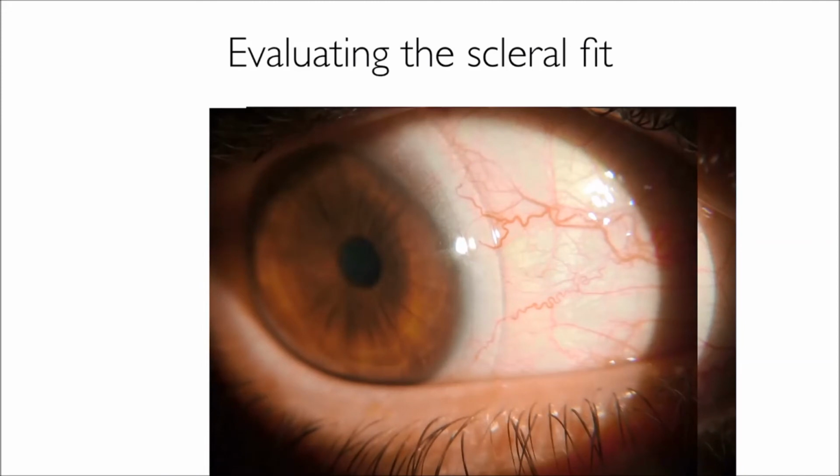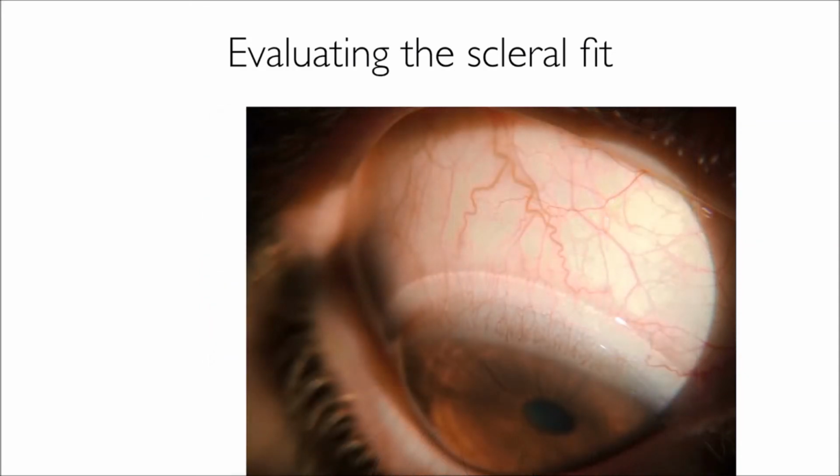They're not inflamed or engorged. It's pretty much normal conjunctiva. And as I look superiorly, I find the same thing. Now, one thing that you want to be aware of, when you have the patient look down, the lower lid can be pushing the lens against the eye and create what I call lid-induced blanching. That is temporary, and it's just while they're in that secondary position of gaze. It's not something that you have to be concerned about. So very small light areas of blanching, very slight areas of congestion, we can accept.